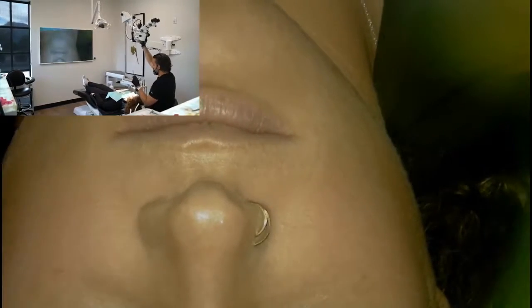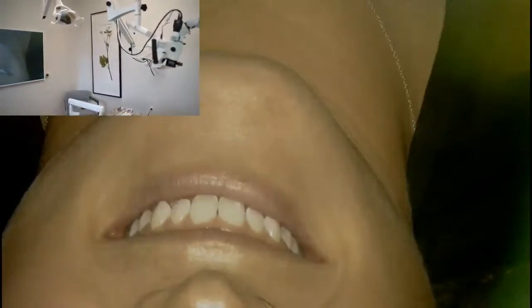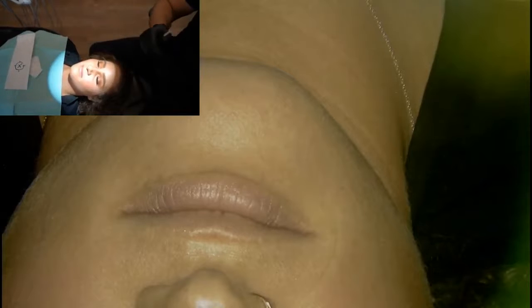You can see that I've got the light in the patient's pretty eyes here. Say hi, smile, show them your eyes. Now you're blind, seeing dots. But if you go up high, Michael, if you want to come in on the ring around her face, her eyes are closed because the light's in her eyes. To overcome that, and it helps for patient privacy, you would actually put dark goggles over her eyes.